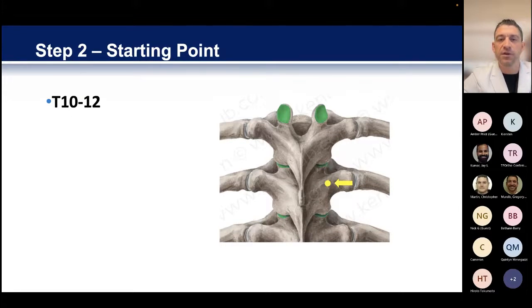If you're in the lower thoracic spine, you guys will hear me talking about that ridge that exists on the transverse process. That ridge is oftentimes a little bit of a key to finding your way into the pedicle. Frequently it is the actual starting point because that ridge does seem to move in the same cadence that I'm going to show you here. But from T10 to 12, something to think about is just the midpoint of the transverse process.